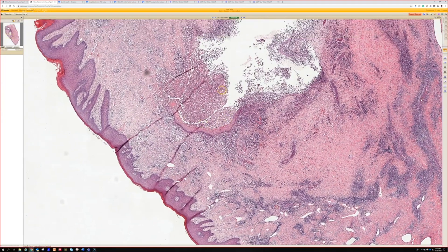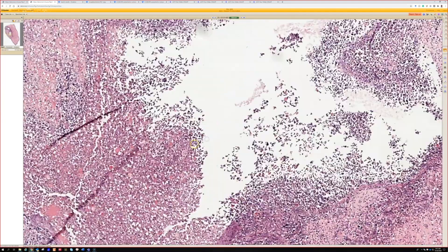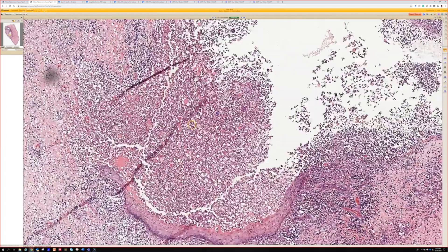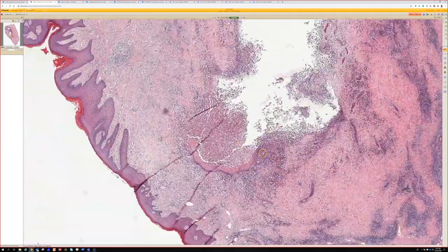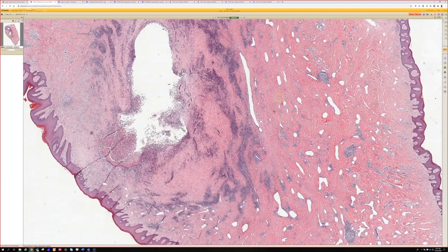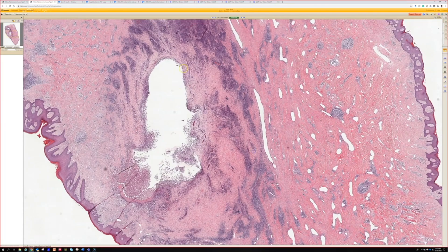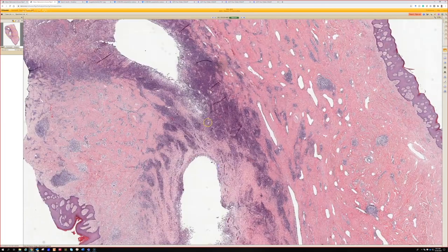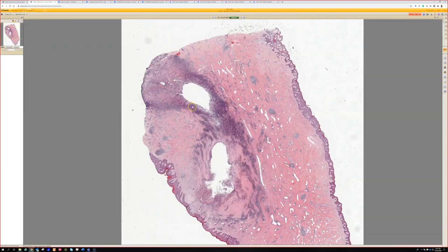This is a cyst wall, neutrophils making an abscess. And then around it, you got granulation tissue, brisk lymphocytes and plasma cells and scar. So it could just be a big ruptured cyst, but in the right setting, this could also fit perfectly with the kind of draining sinus that you see in hidradenitis.